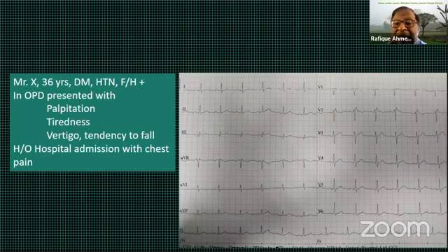And if you draw a line, in lead V2, the second QRS actually ends at a line, you can see it. And if you go down straight, you will find that in V6, that's in the ST segment. So even with this subtle change, even though it looks like RSR, actually that's the ST segment.